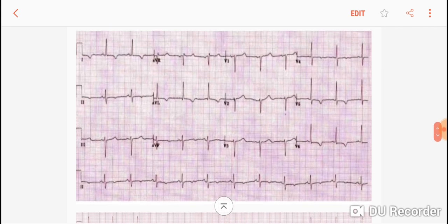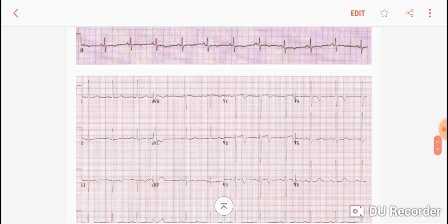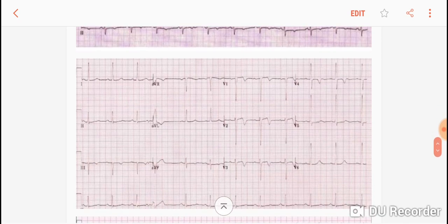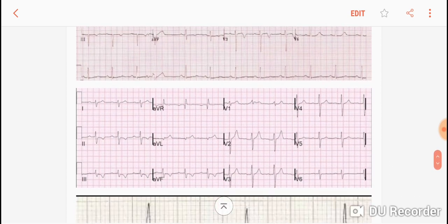Right here you have V1, 2, 3 and V4 T wave inversions, so it is an anterior wall ischemia and NSTEMI if the cardiac markers are positive.